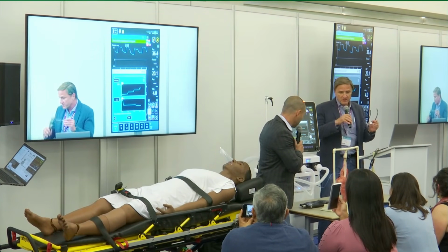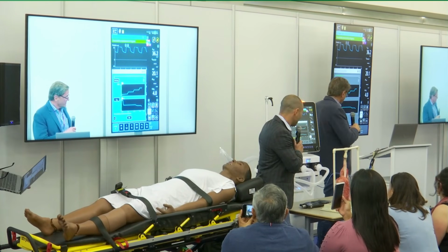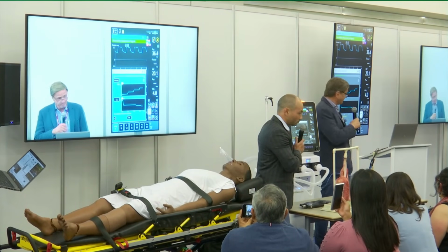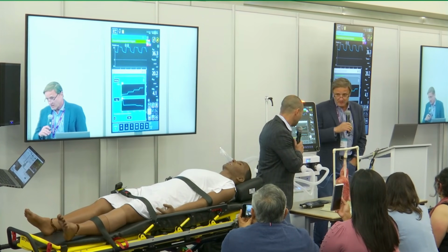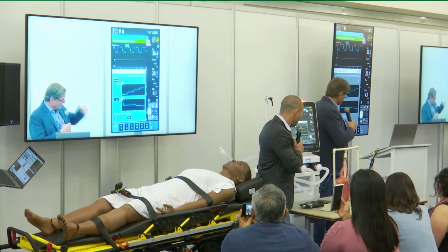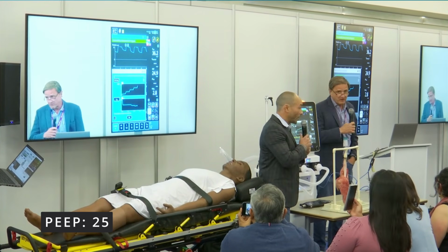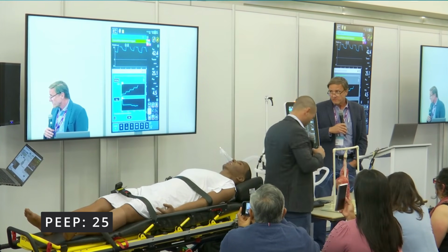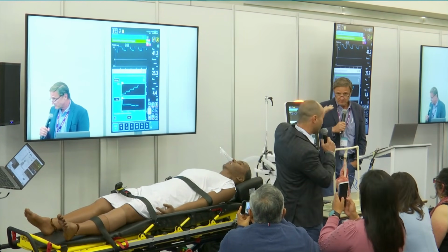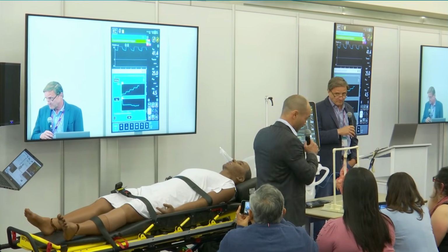Very important to look at hemodynamics at this point. Yes, it's what we call quasi-static. And typically in the, let's say, incremental phase, compliance always drops down. It's very unusual that it goes up, only in very... 25. This is the maximum step, right? Yes, and now we're gonna start going down again. Yes, plus 15. Yes.